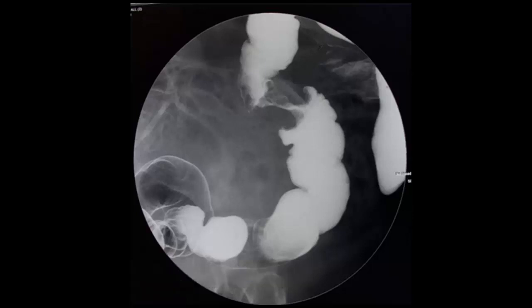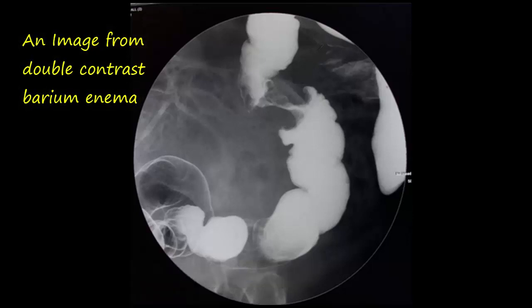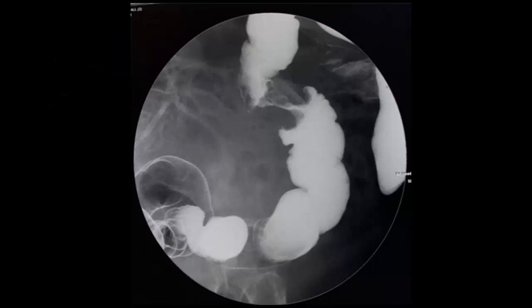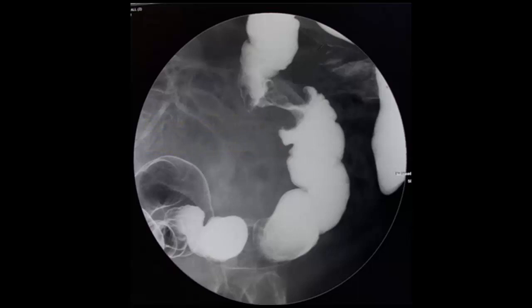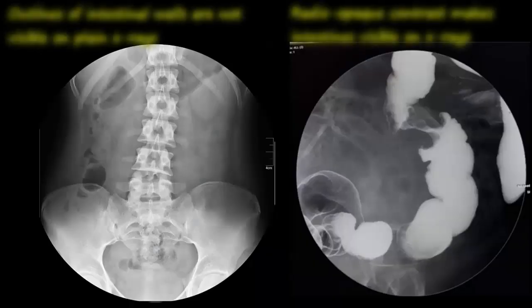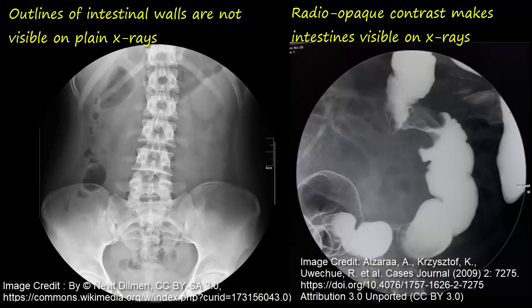The x-ray image in front of you is from a double contrast barium enema study. The word enema refers to pushing of a liquid into the rectum through a small tube. In case of barium enema, the liquid contains barium sulfate that coats the inner lining of the colon. Barium sulfate is a radio opaque contrast medium, which means it does not let the x-rays pass through it. Radiographic density of the intestines is similar to many other soft tissues within the abdomen, and therefore it's not possible to view the outline of the intestines on plain x-rays.